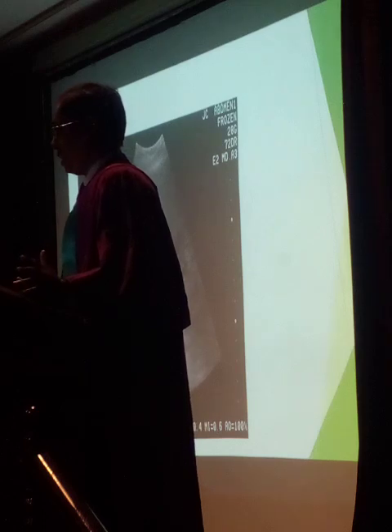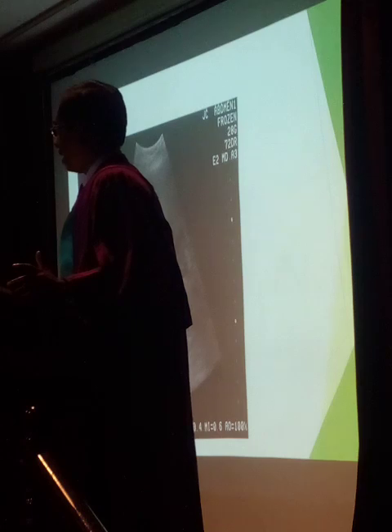When we do ultrasound, most of the time we can't see the pancreatic lesion at once, because it is not easy to see a pancreatic tail lesion or distal body lesion by ultrasound. So most of the time we see lesions in the liver or around the pancreas.